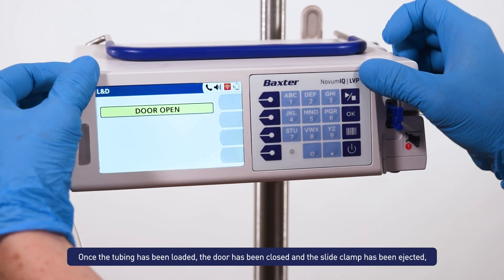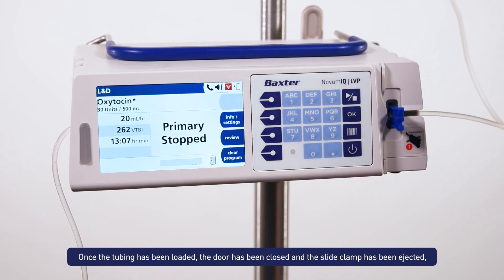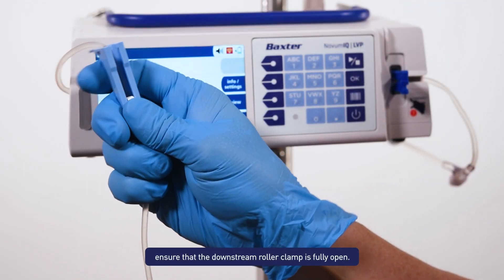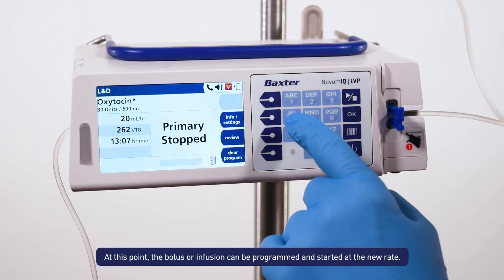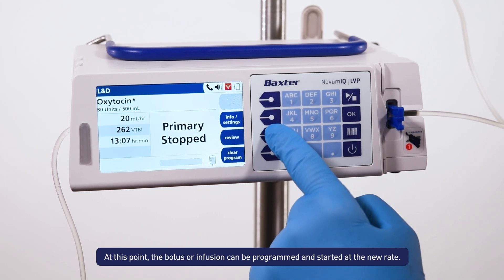Once the tubing has been loaded, the door has been closed, and the slide clamp has been ejected, ensure that the downstream roller clamp is fully open. At this point the bolus or infusion can be programmed and started at the new rate.